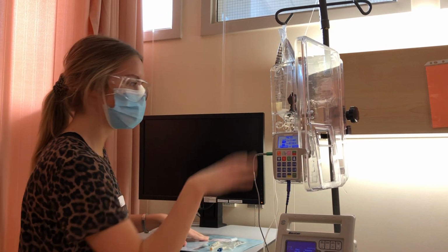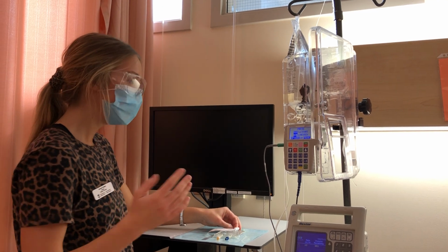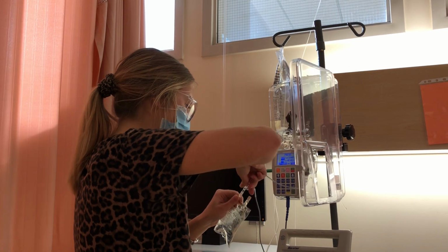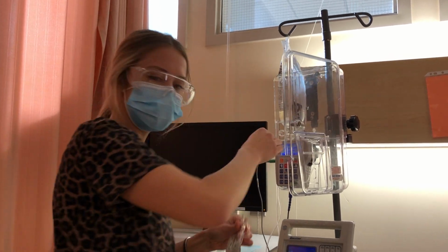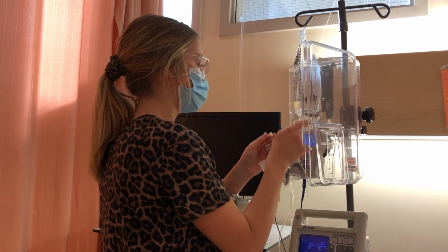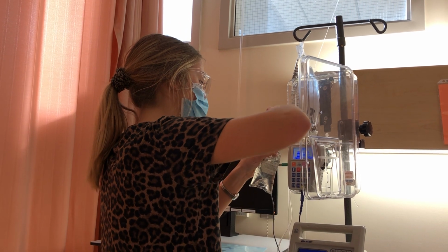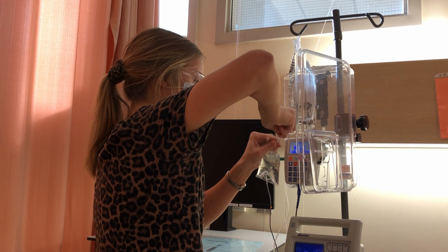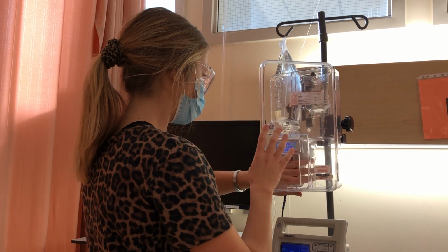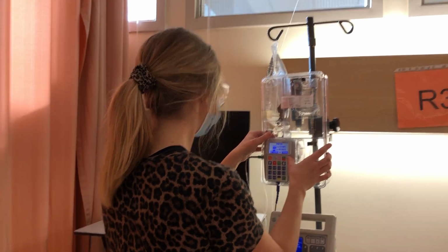Then I would get my second nurse to review this. She would hit no to review and then verify that it's been correct, and it says that it's correct. So now I will go ahead and I'll change the bag. So take this guy off here, making sure I'm maintaining sterility. Before I confirm, I need to spike my bag here. Hanging this up. I would lock this all up so no one can access it.